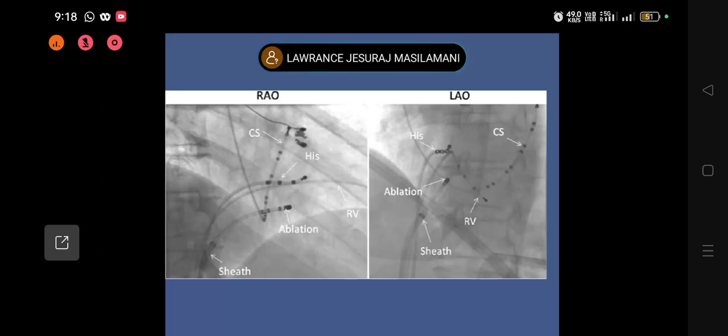The movement should be with the septum, and movement of the tip should be minimal, and upward movement should not be allowed. When you are seeing, during respiration or during your catheter movement, that your catheter is moving upwards, then you should make sure that you keep catheters a little stabler by pulling it down. You always pull your whole catheter assembly low and keep them clocked and kept in a very tight position so that they don't move. This catheter should always be in this location.